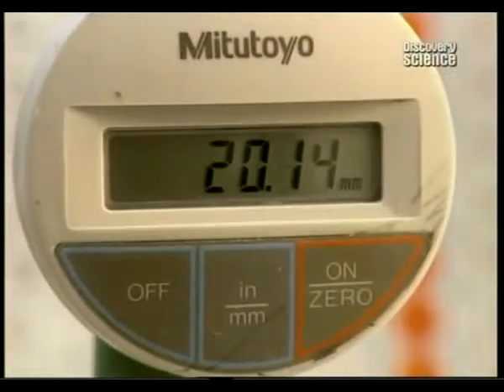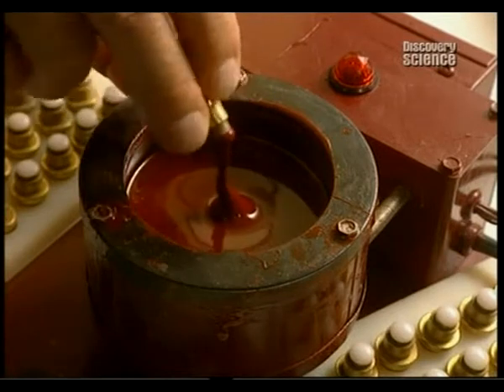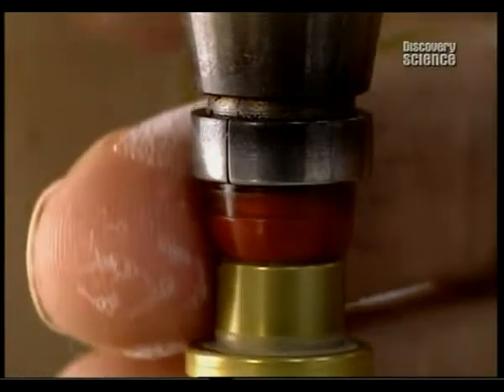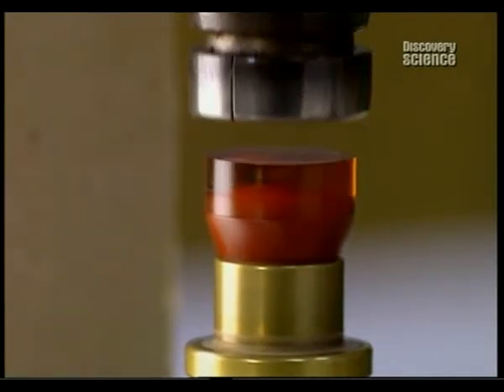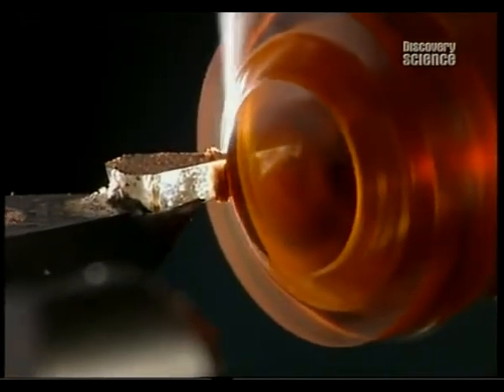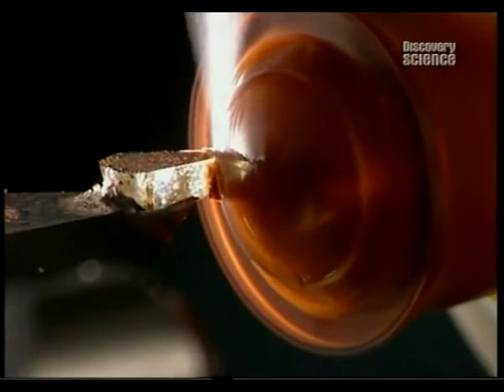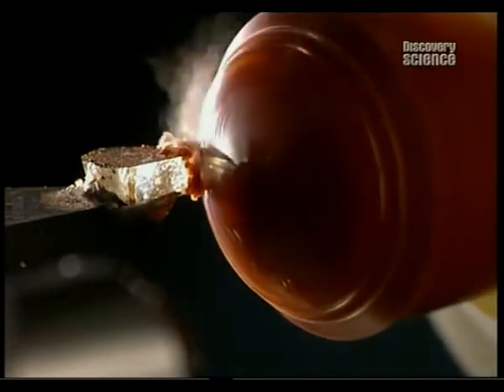A technician measures lens thickness with an extremely precise gauge. The outer surface is then shaped, the part which touches the eyelid. The lens is glued to a spinning arm with a special wax, which will be removed later by an ultrasound device. The wax is moulded in just seconds. The outer diameter of the lens is now shaped as the computer controlled arm effortlessly cuts away the excess polymer and is polished.